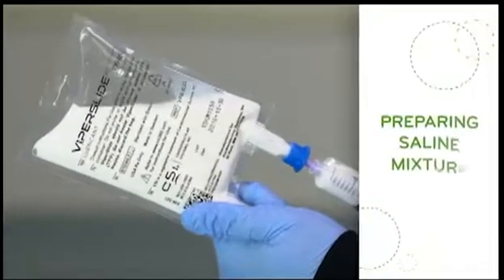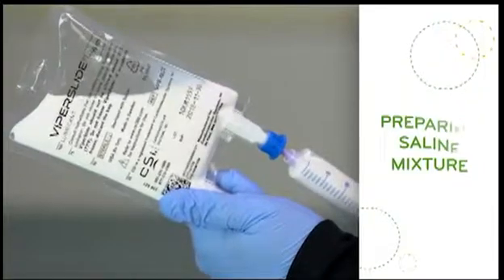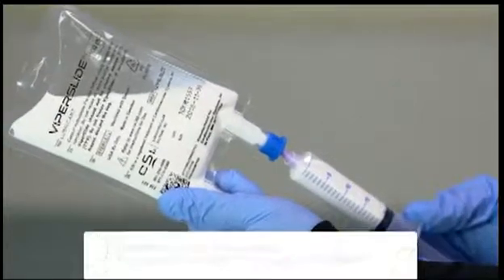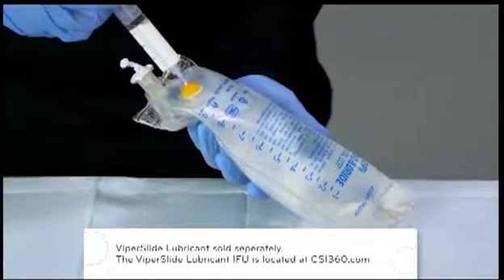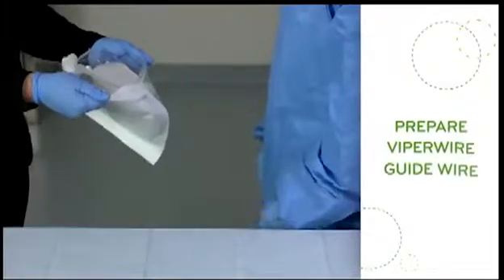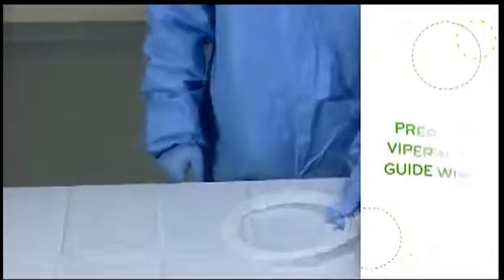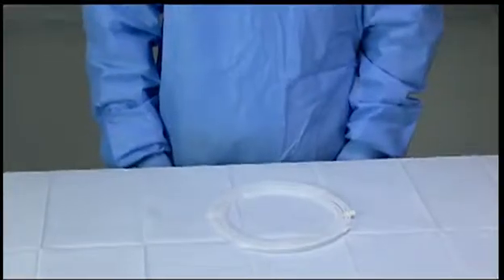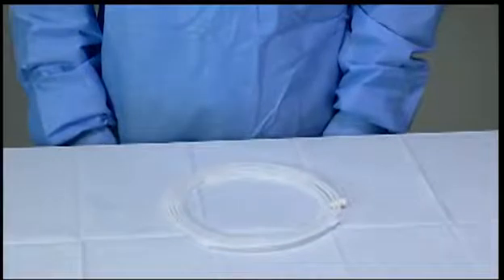To begin setup of the Diamondback 360 OAS, draw 20 milliliters of ViperSlide lubricant solution from the lubricant bag and mix with a 1,000 milliliter bag of normal saline. Using sterile technique, open the pouch and extract the packaging tube that contains the guide wire. Remove the guide wire, taking care not to stretch or damage the distal spring tip when removing it from the packaging.